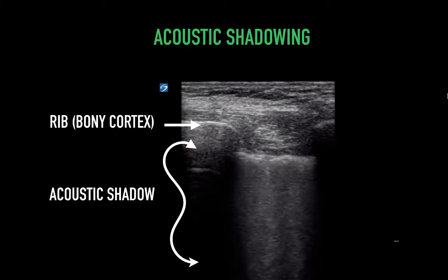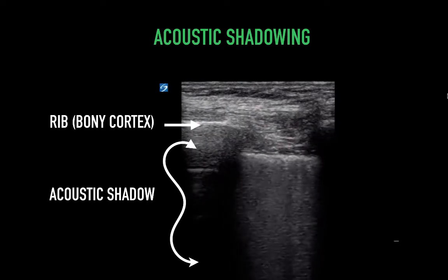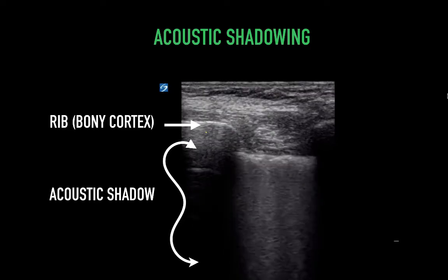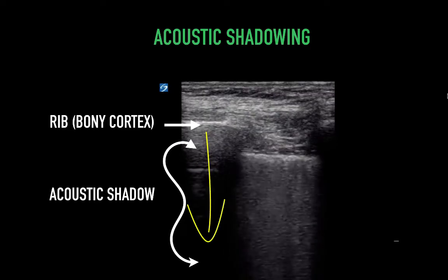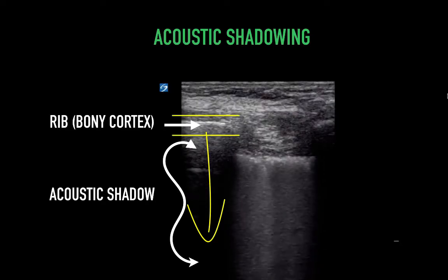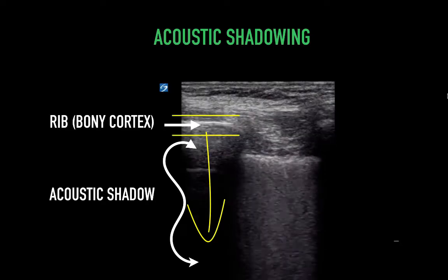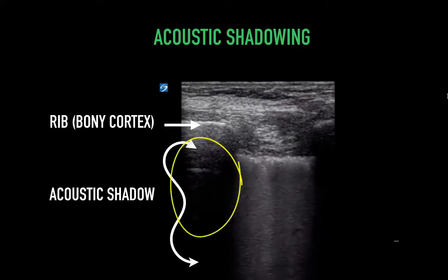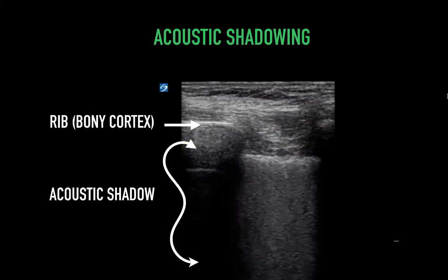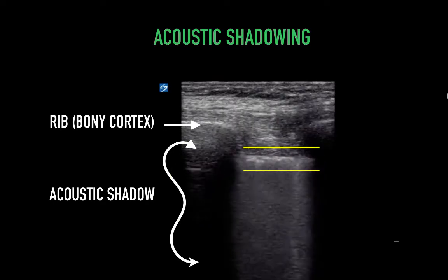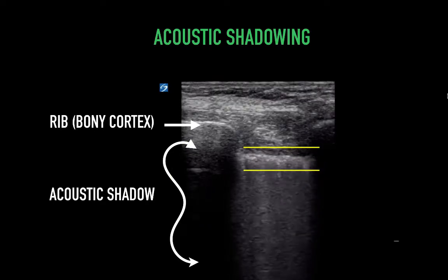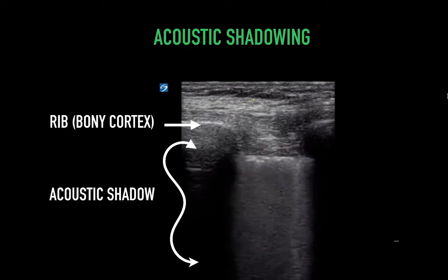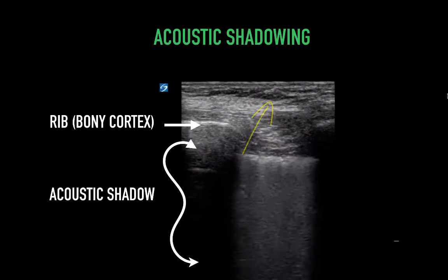Acoustic shadowing occurs with a particularly strong reflector or attenuator, leading to a diminished ultrasound beam. We see lost imaging data distal to the reflector or attenuator. This is often recognized below the rib or bony cortex, where we see a lack of imaging data — what you're seeing beneath here is in fact an artifact. This is often seen at the pleural line as well, with a healthy tissue interface, as the big difference in acoustic impedance leads to the pleural line being a strong reflector, or a bright hyperechoic line.